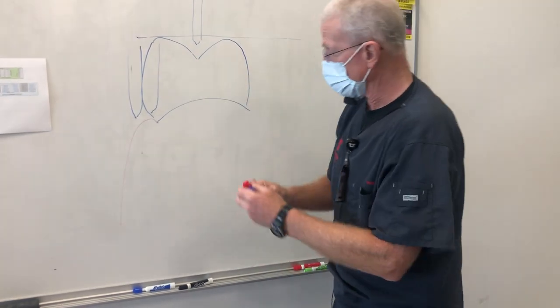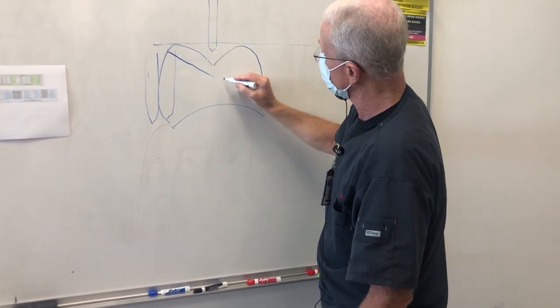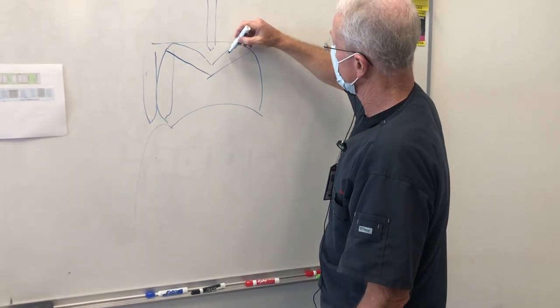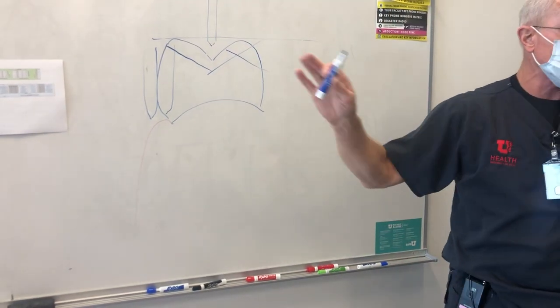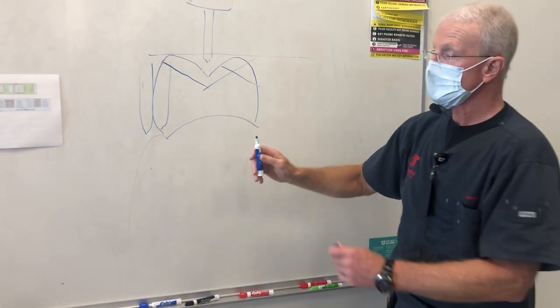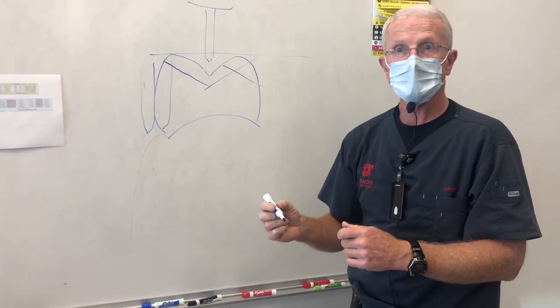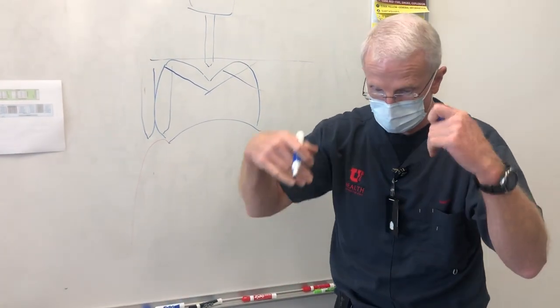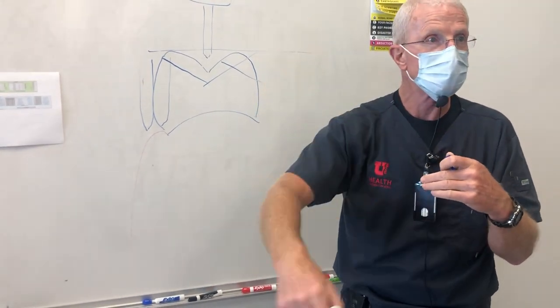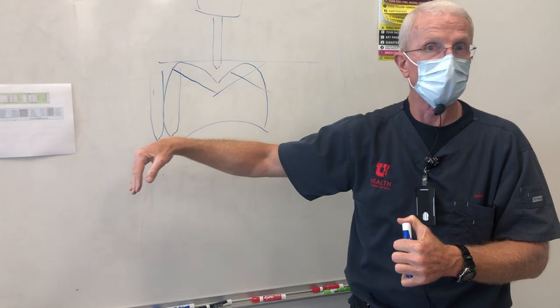Once you have your buccal axial wall established, you've already done your non-functional cusp occlusal reduction, your non-functional cusp bevel, your functional cusp, and your functional cusp bevel. You've already taken the top of the tooth off. Then you go to the buccal axial wall. Once you've got the buccal axial wall, then you go interproximal, and try to do that with direct vision. Have the patient get into a position where you can see with your eyes, not through a mirror, and you just go from buccal to lingual. You've already broken contact, and now you're just going to establish that axial wall interproximally.